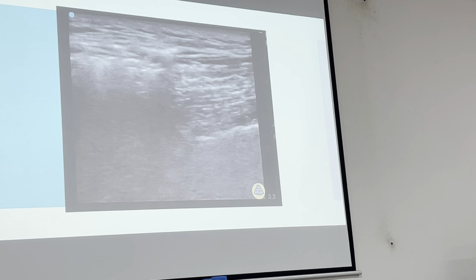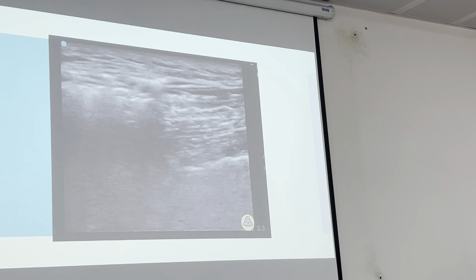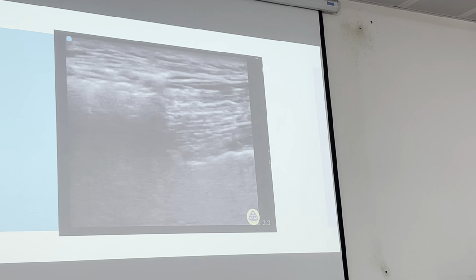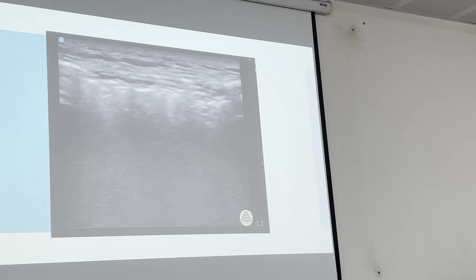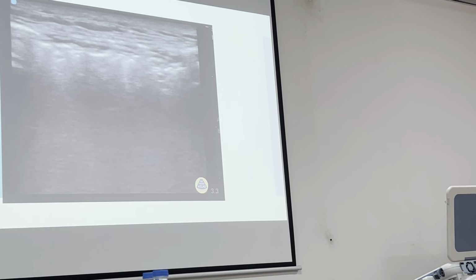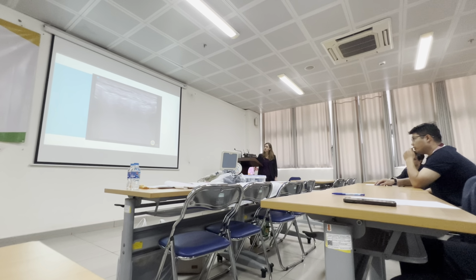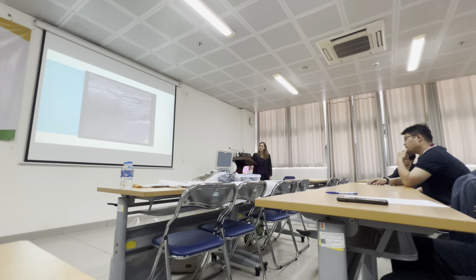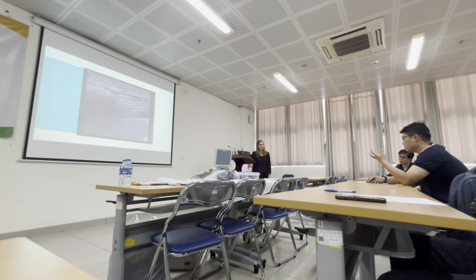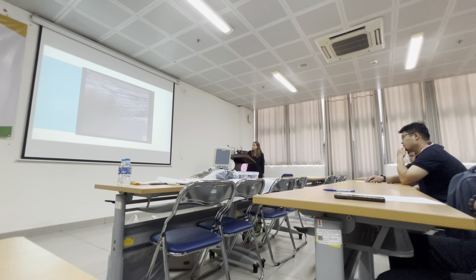On the first one or two seconds, it's kind of normal. I think it's normal tissue. And in the final seconds, there is some kind of hypoechoic area. Okay, without any clear fluid. But I see some cobblestoning in that area. I think it's maybe a ruptured abscess. A ruptured abscess? Yeah. Okay, maybe. That's a good thought. So, I agree with you.